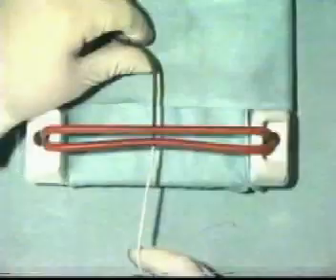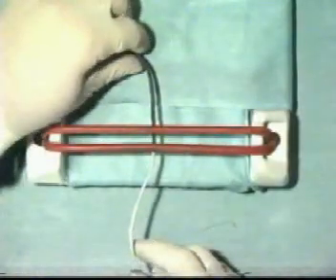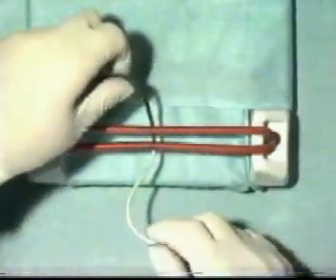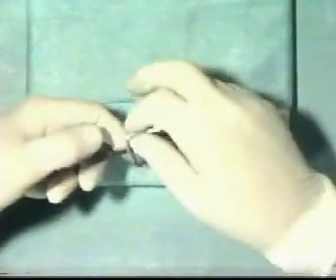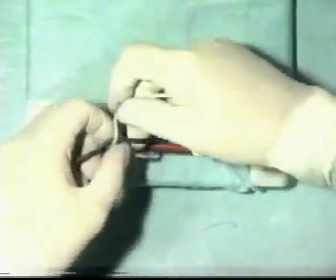Let's tie this now once more in slow motion. Take the threads and cast the first throw of the reef knot, and then take the thread through once more.